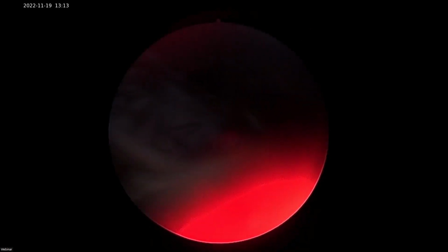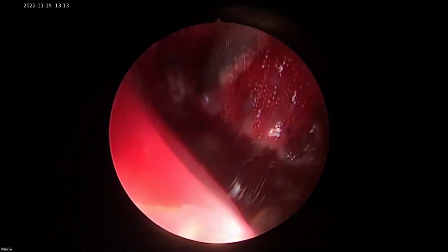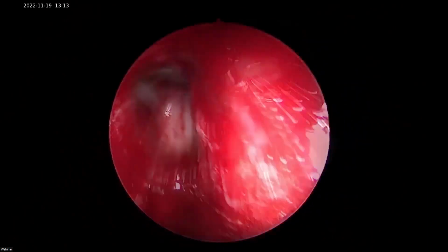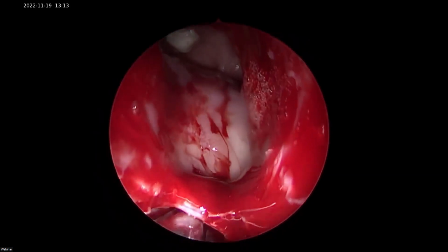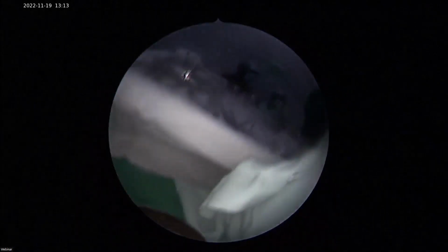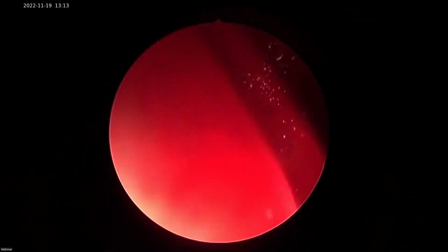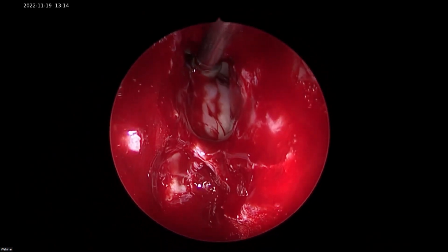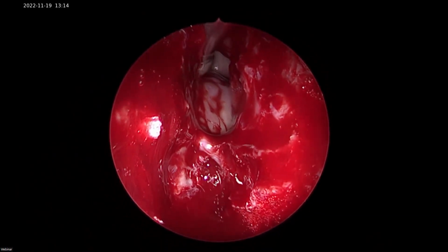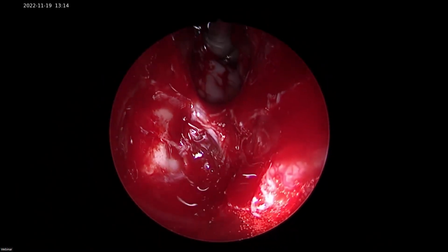Yes, thank you so much. Okay, excellent. अभी भी है एक जगह पे. चलो, we'll go exactly there. Withdraw this. Then you'll have to push it. 90 degree मांगता है. Push it. Flush जोर से.